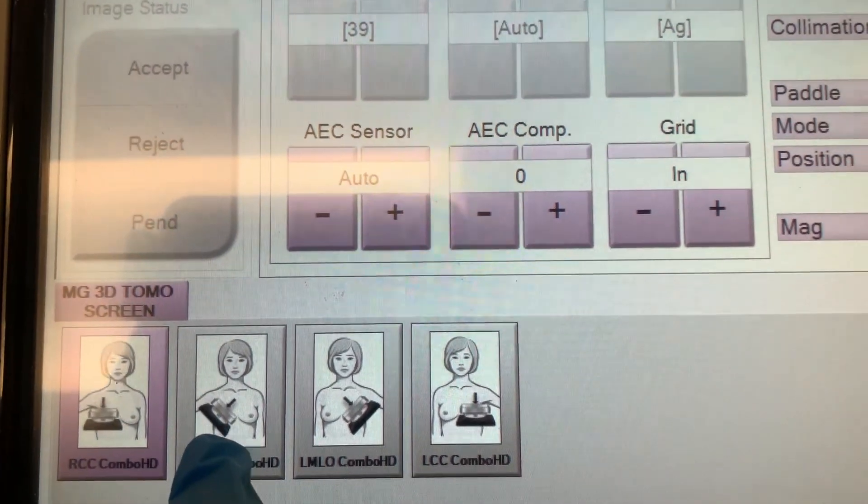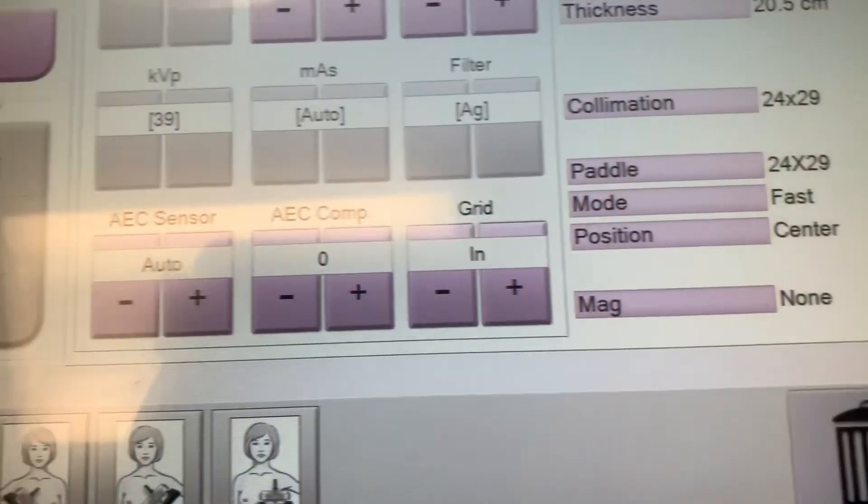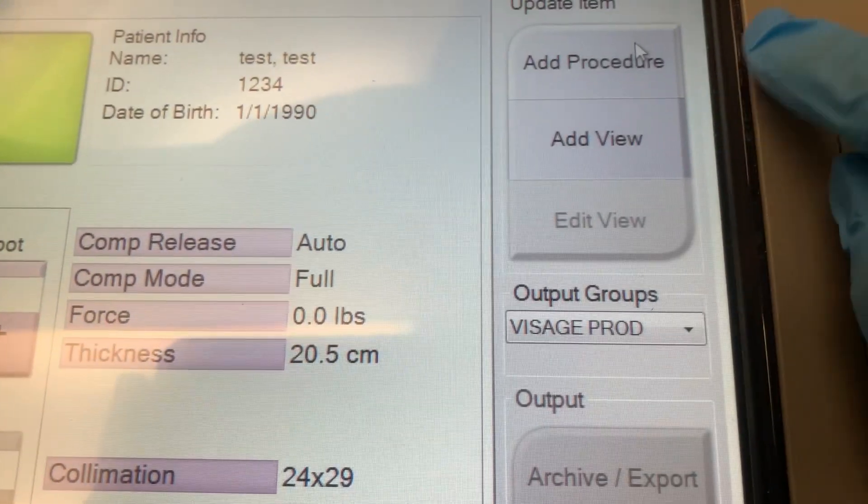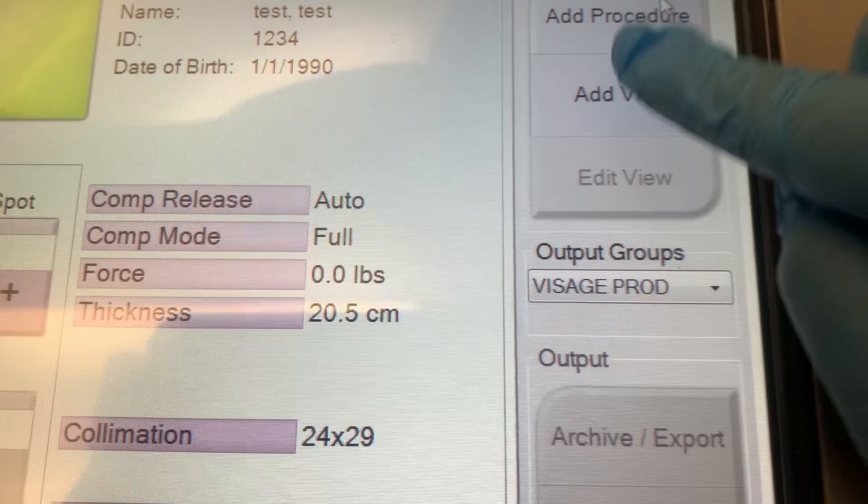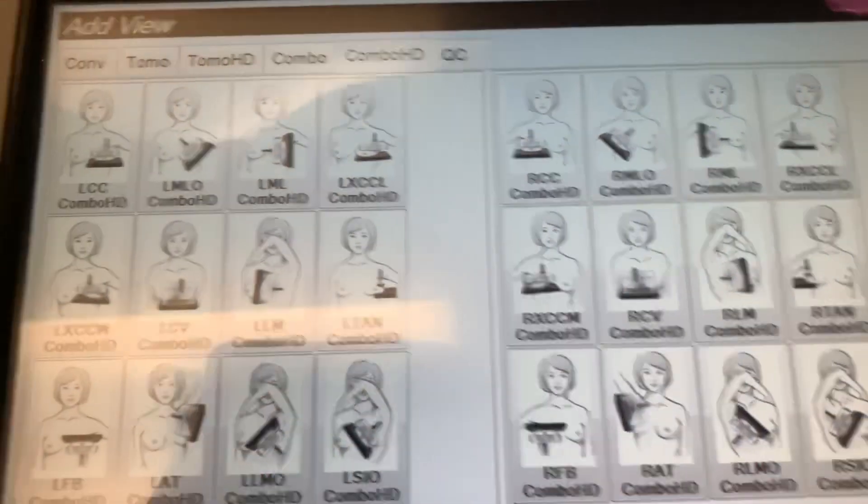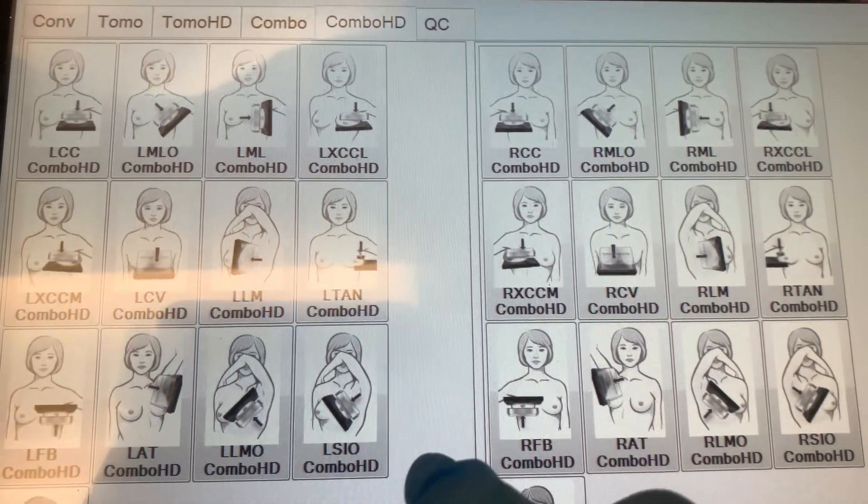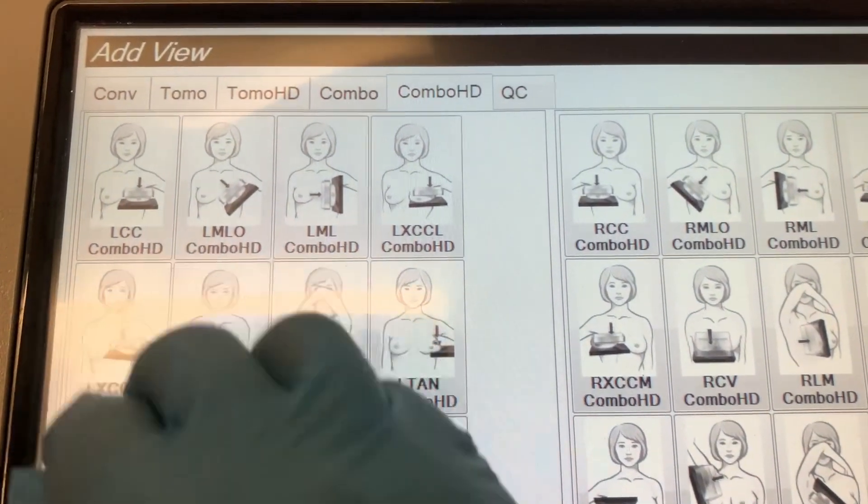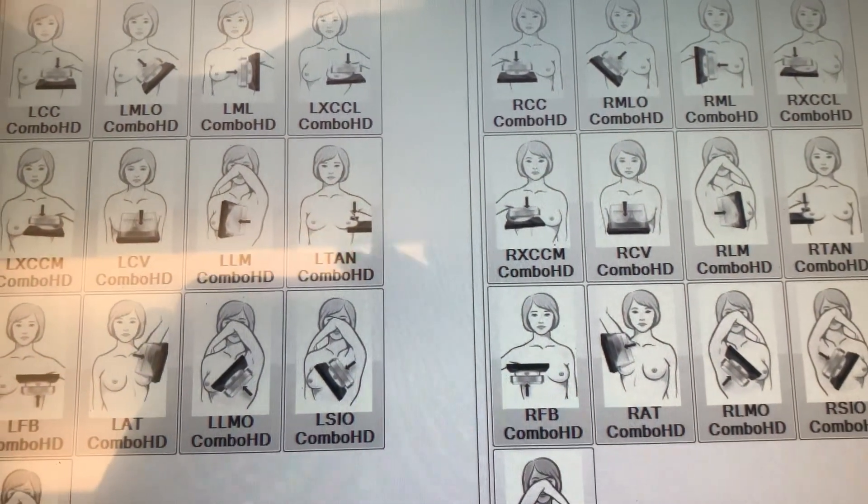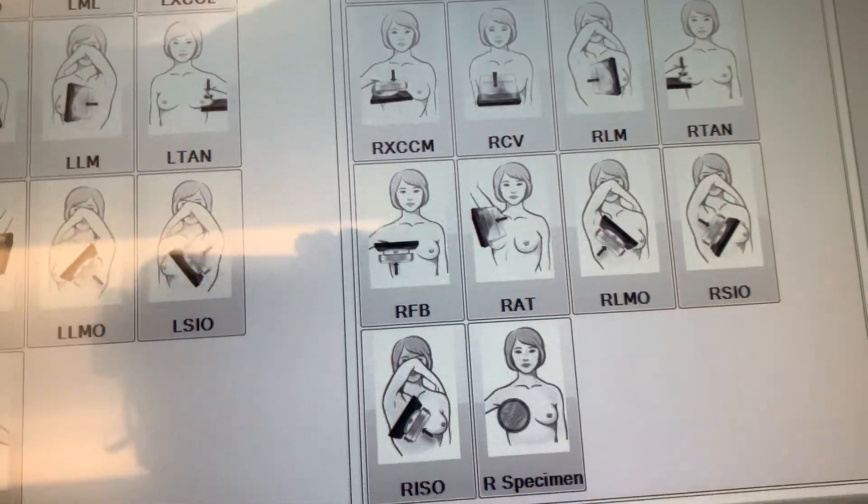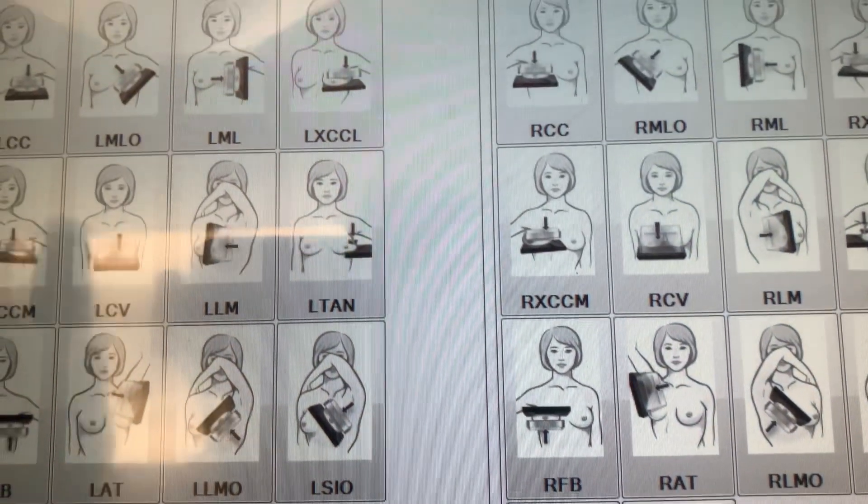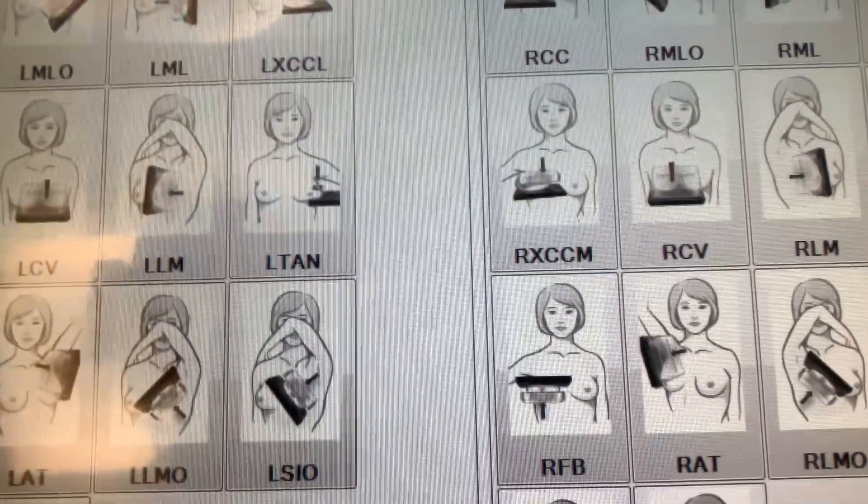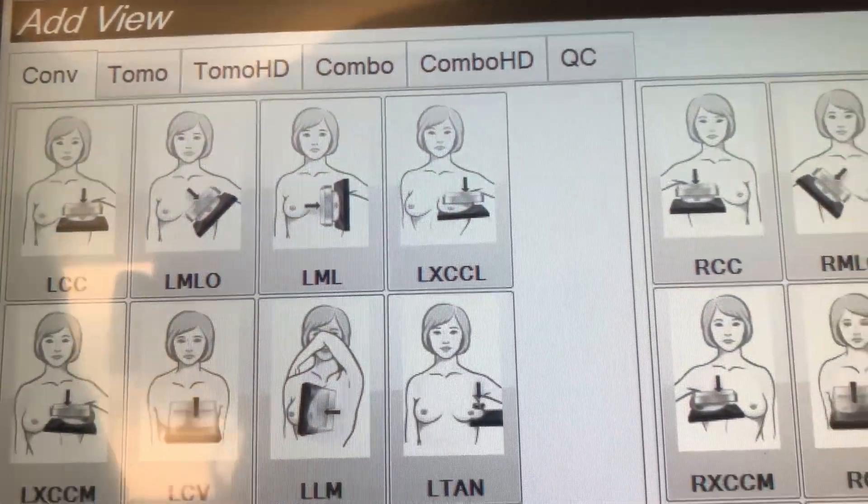Your CC, your MLO. And then if you want to add a procedure or, well, let's add a view. First, let's add a view. So these are the different views, like the compliment view. If you cannot get it all on one picture, then you can do like an XCCL. And I just hit conventional right here.